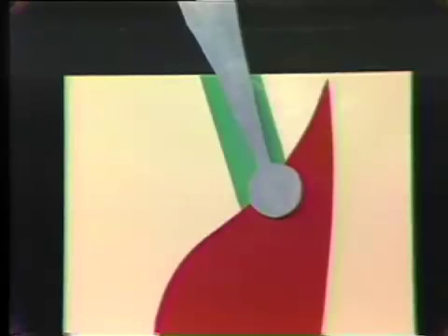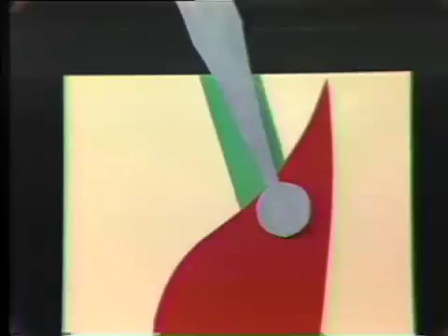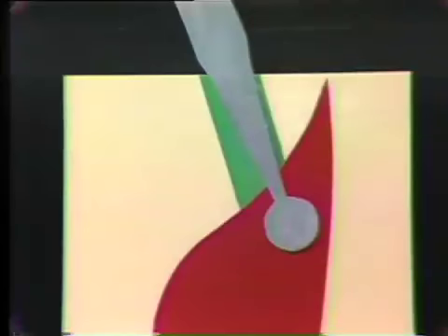Now that the burr is in the pulp chamber, we want to unroof the pulp chamber working from the inside out. With the burr not running, we want you to feel around the anatomy of the pulp chamber a bit, just so you'll make sure that you know where the roof is and unroof that as opposed to gouging the walls. So you can stick the burr a little bit farther down, feel where the walls are, run the head of the burr against the walls with the handpiece off.